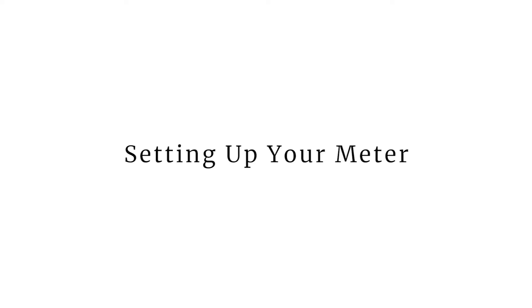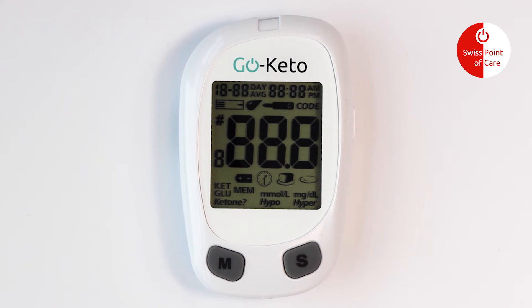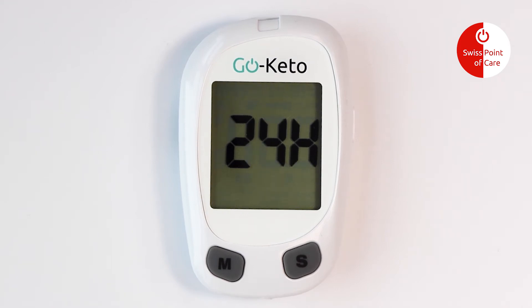Meter setup before testing. Press and hold the S button for 2 seconds to enter the meter setup mode. The meter will automatically enter the setup mode when turned on for the first time.